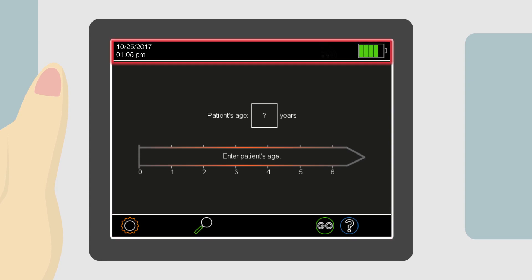The header bar is like a title page. The header bar displays date and time, a symbol for an active wireless LAN connection, and a battery charge indicator.